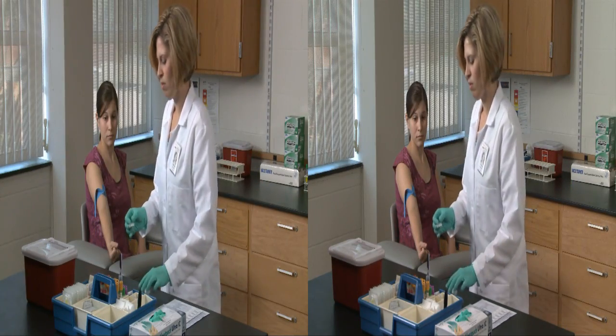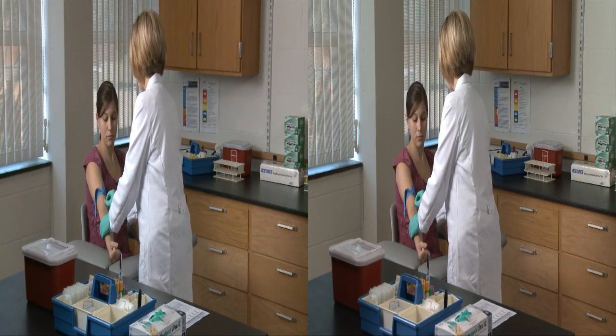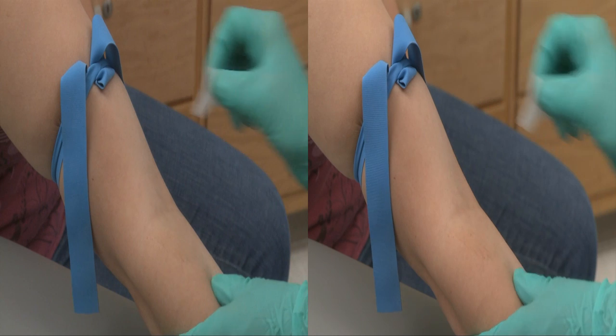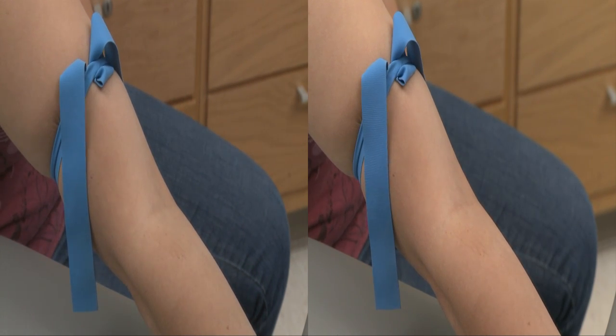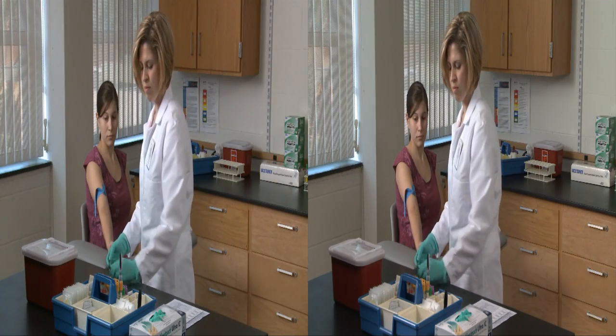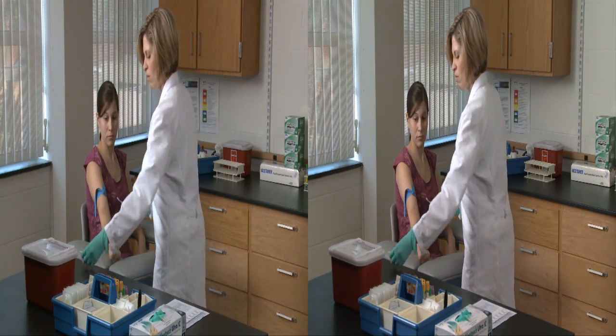Use an alcohol prep pad to cleanse the skin around the site. In a fluid, circular motion, swab from the center to the periphery of the site, being careful not to drag the pad back across the cleansed field. Let the area air dry. This prevents contamination of either the patient or the specimen.